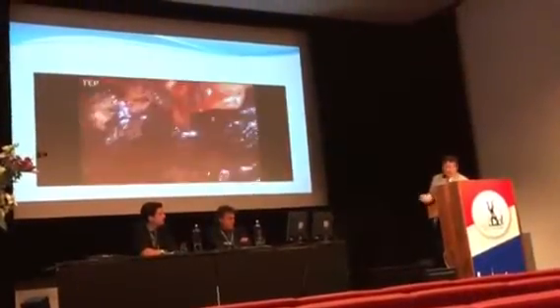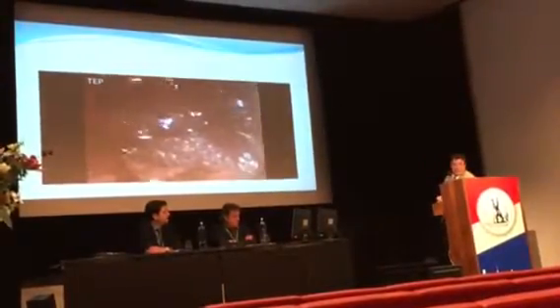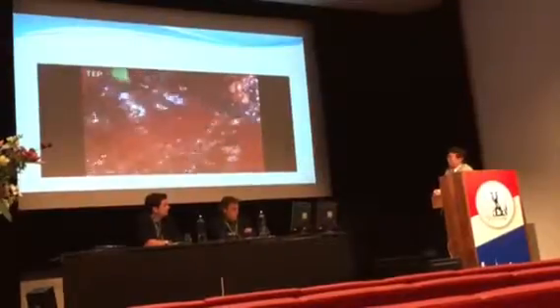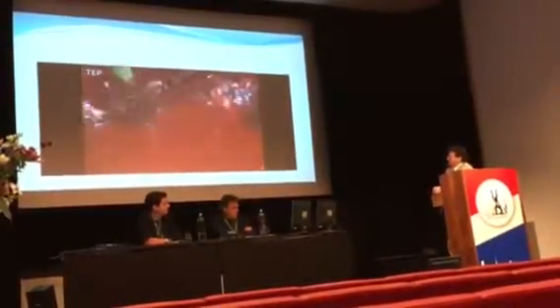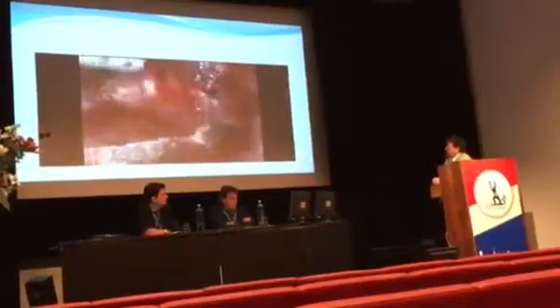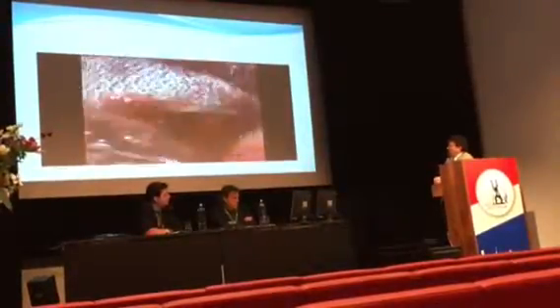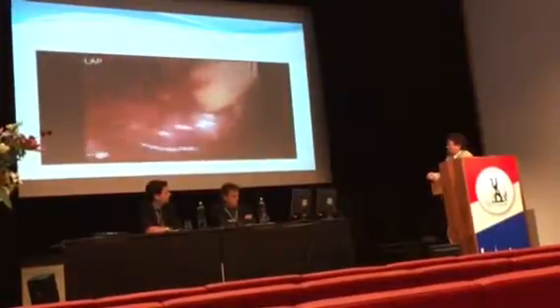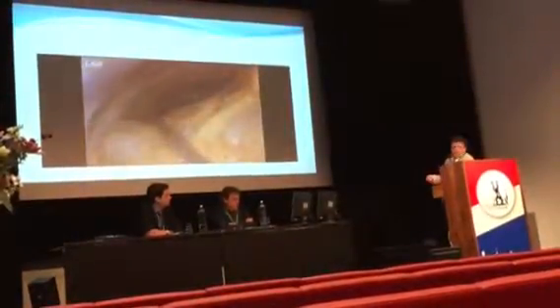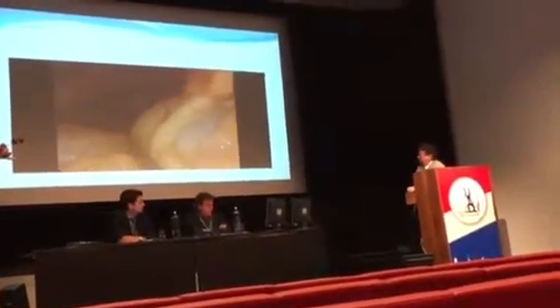And one application of this approach is when you have postoperative bleeding in a TEP procedure with extensive hemorrhage, you can also use this approach. You can deal with the huge preperitoneal hematoma. You can wash and drain it, localize the bleeding point, and review how the mesh was displaced by the huge hemorrhage. And you can see from the intraperitoneal view how the huge preperitoneal hematoma was displacing all the peritoneal cover, and also retrieve all the blood in the subphrenic area. So it's one application of this approach.